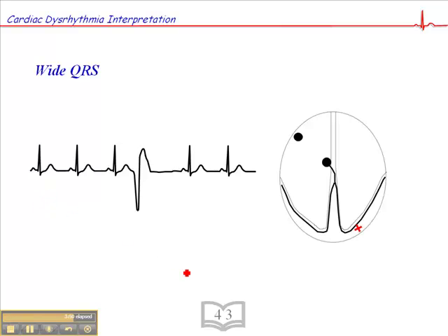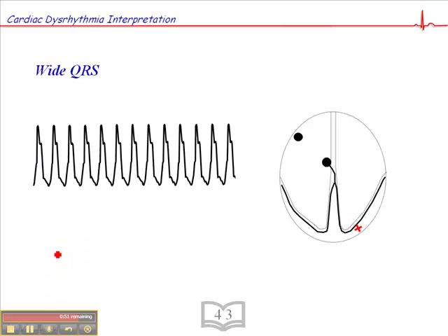Other causes of wide QRS include ectopic premature impulses. Here we have a premature ventricular complex where the underlying rhythm is sinus, but an ectopic focus fires earlier than expected, producing a wide PVC. Here we have ventricular tachycardia, a wide complex tachycardia without discernible P waves. This results from an ectopic focus in the ventricle firing consistently. Again, the QRS is equal to or greater than 0.12 second.